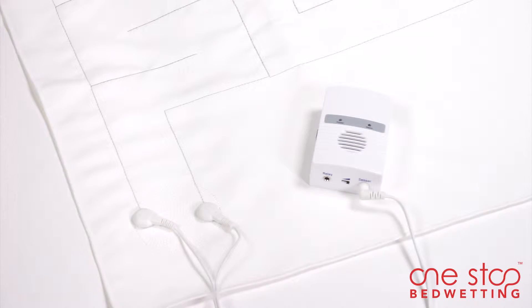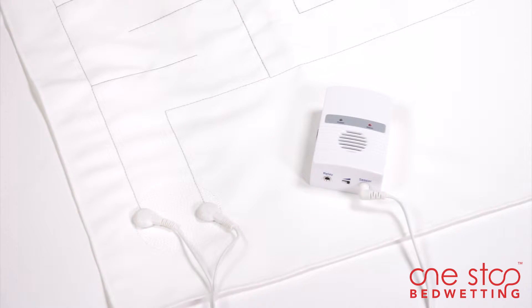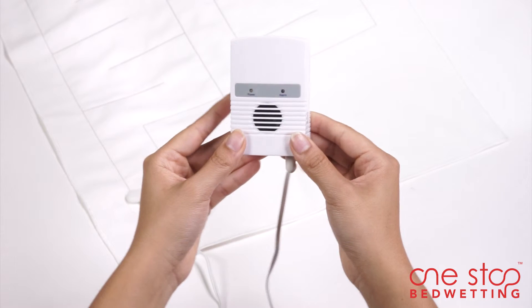The soft, comfortable, machine washable cloth mat offers a large urine detection area and alerts users on detecting the first drop of urine. The alarm beeps and flashes a light to wake up the user.